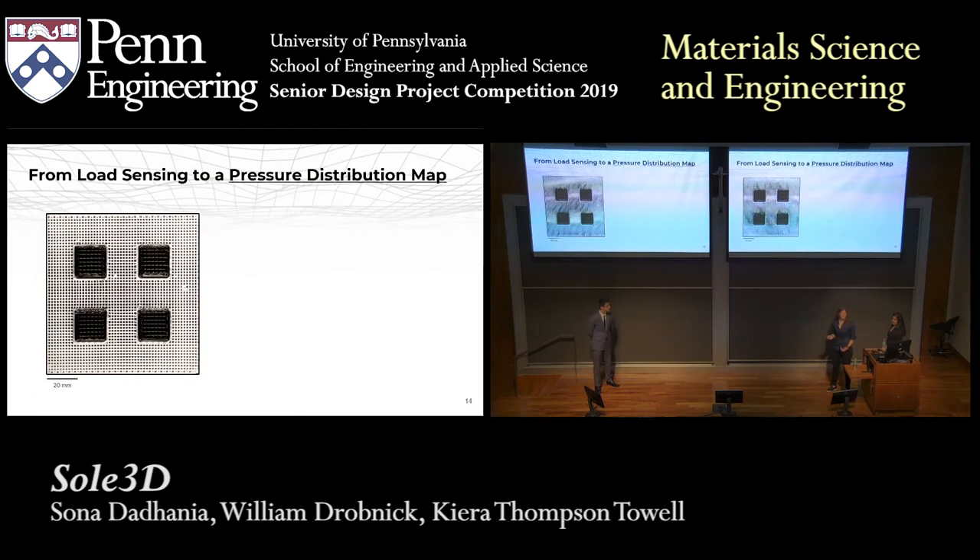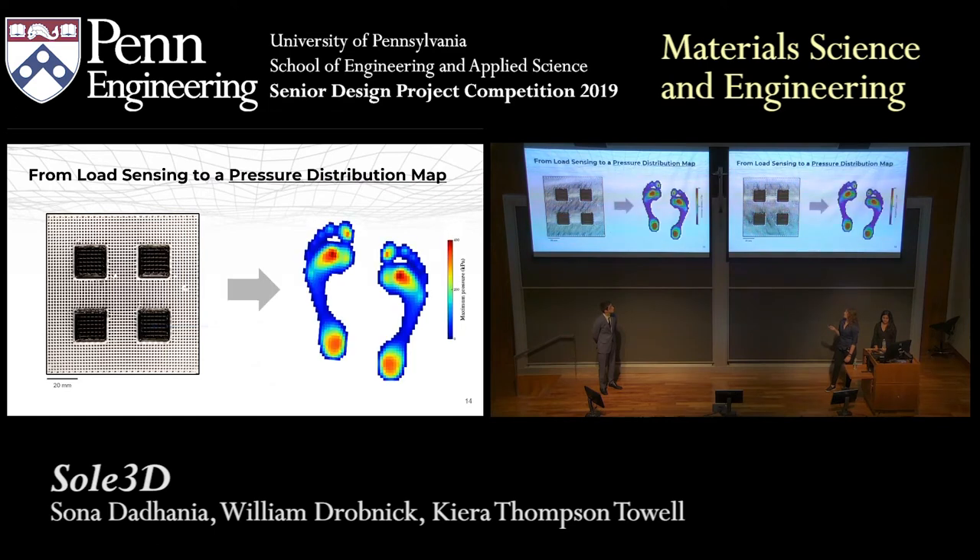Our next step was to scale our single sensor into a larger array. This enabled us to get more localized data on where the force is being applied. Here we have four carbon black sensors in an overall non-conductive PDMS matrix. Each of these sensors acts as a pixel for a force distribution map, meaning that as we increase the number of sensors and decrease their size, we get better resolution and can end up with a pressure distribution map. One huge advantage of 3D printing this material is that we can simultaneously print both the conductive and non-conductive material, embedding our conductive material into the insole with only one manufacturing step. Another advantage is that it allows the insoles to be customized for each individual — we can increase the number of sensors in high-pressure areas to get better readings and increase the stiffness to provide better support.